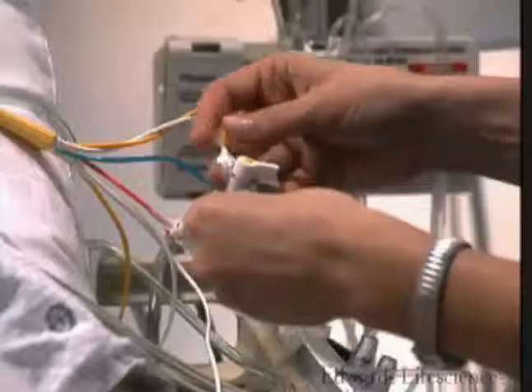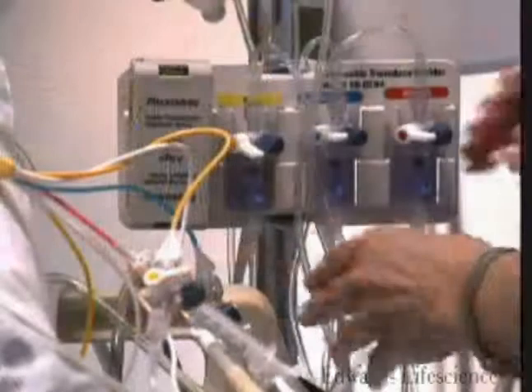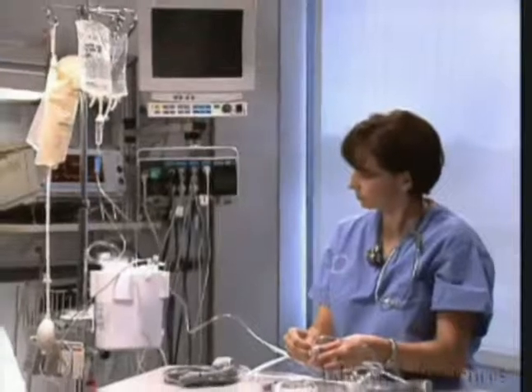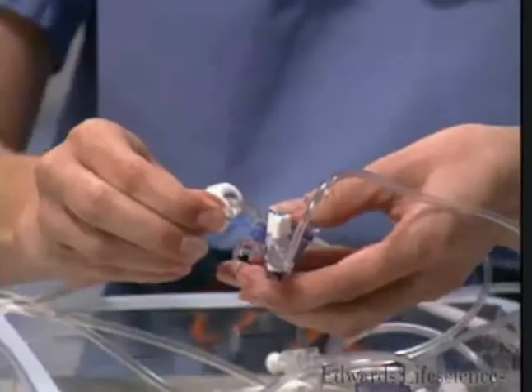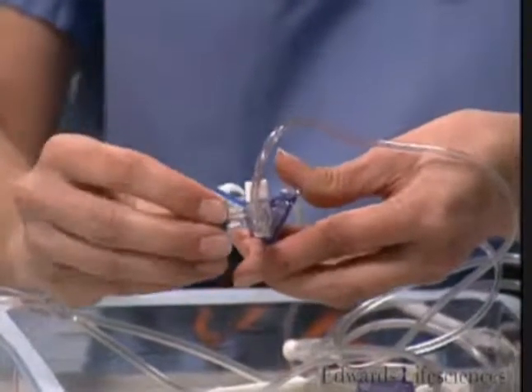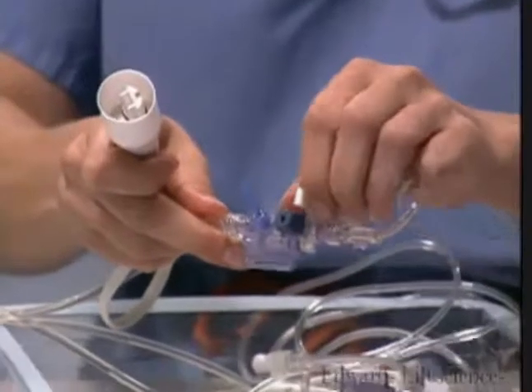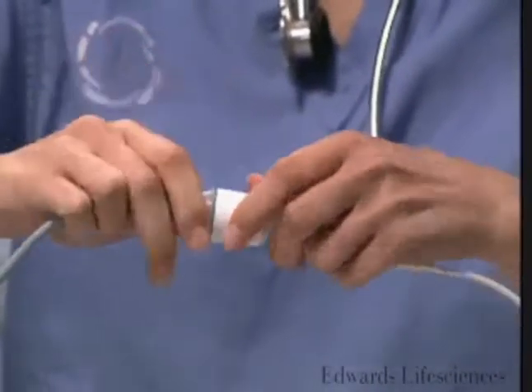The transducer is attached to the catheter with short, non-compliant tubing. Stopcocks should be kept to a minimum and used only where necessary. Initially, the tubing should be filled by gravity rather than under pressure. In addition to the tubing, all stopcocks should be completely cleared of air, and the vented cap should be replaced with non-vented dead enders as the line is flushed. Tighten all connections. The most common transducer in use today is disposable. All disposable transducers have been pre-calibrated and do not require any further calibration.